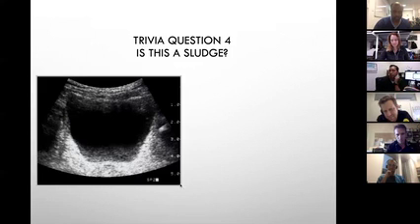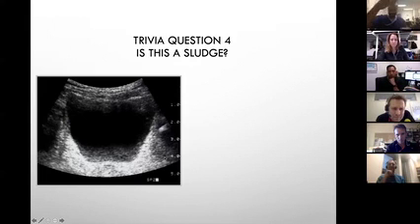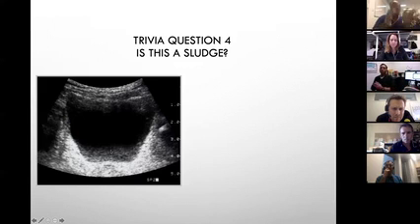Can it be a slice thickness artifact? Okay. Imagine we are scanning the bladder transverse. If I'm capturing the anterior and the posterior wall that goes around in one slice thickness, you'll capture some of the wall in that area. Does that make sense? If you're slicing the bladder, you get this kind of echogenic wall because you're capturing the anterior and posterior wall going down. So now the question is, how do we prove this is a slice thickness problem, not a sludge? That's our clinical worry.